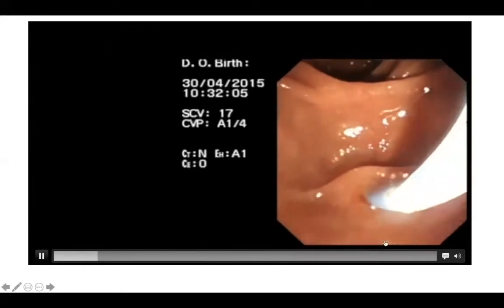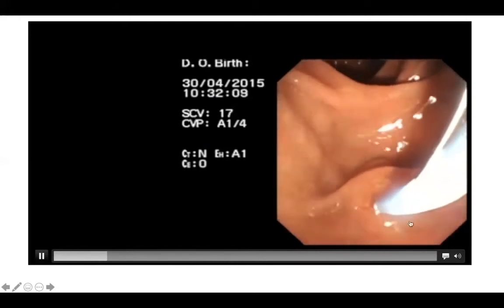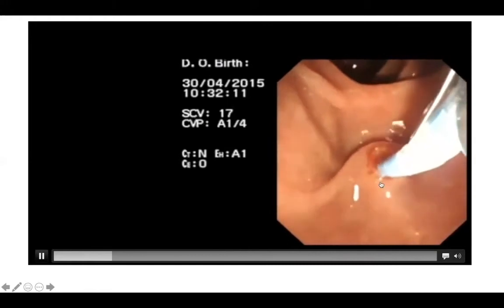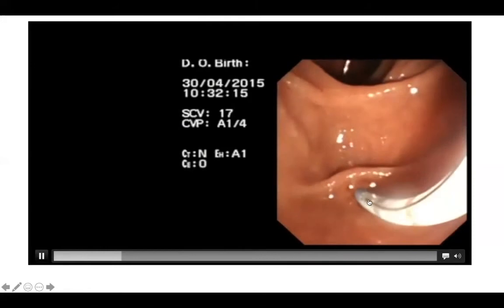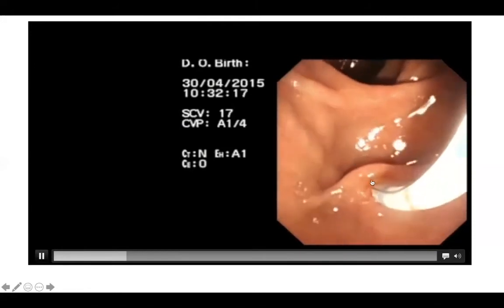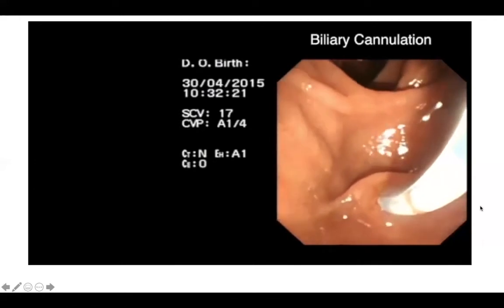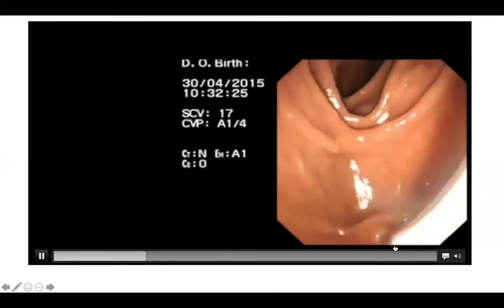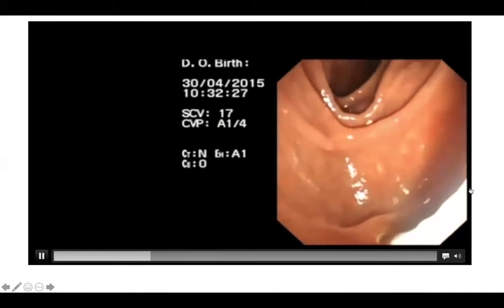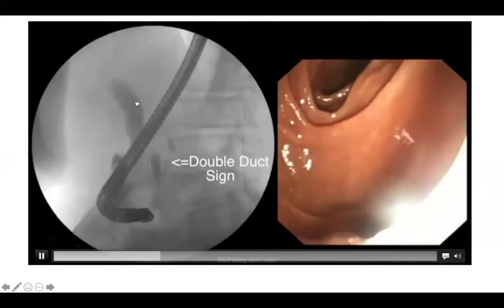Now we will start an ERCP with selective cannulation with a sphincterotome in the direction of the common bile duct, from below upward, opposing the 11 o'clock position. Then we will try to insert the guide wire through the sphincterotome into the CBD very gently before injection of any contrast. When the guide wire is inside the biliary system, we start to inject contrast media.